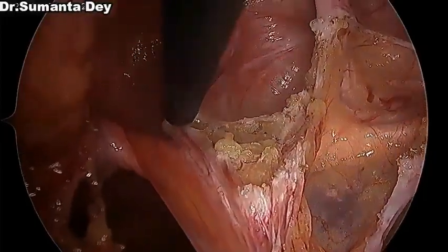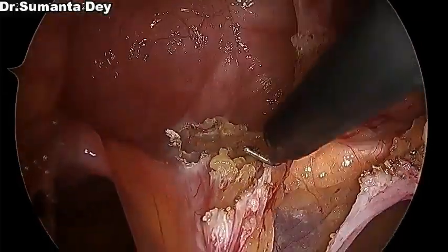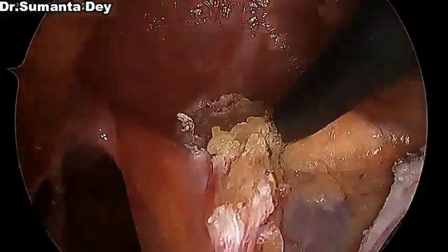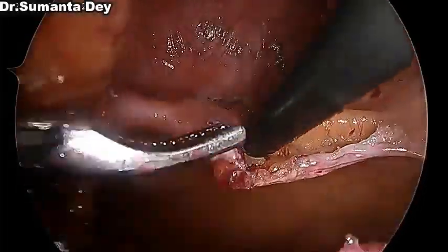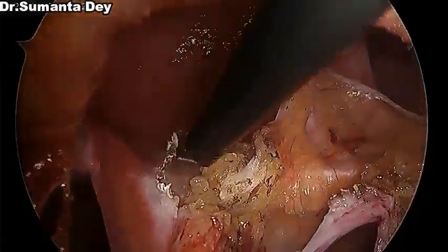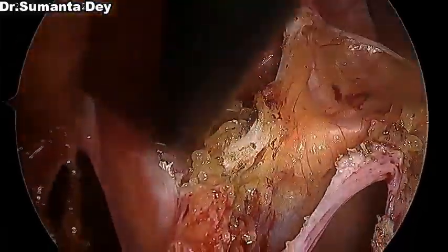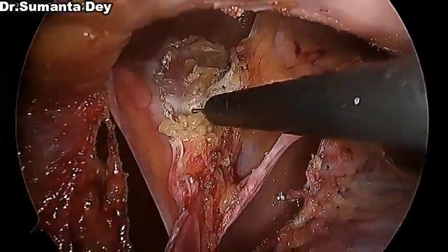So for me, I always believe the preperitoneal plane is the most physiological plane where you can place a mesh while doing your hernia repair. And if it is possible, one should always try to do a preperitoneal repair, be it open or laparoscopic.